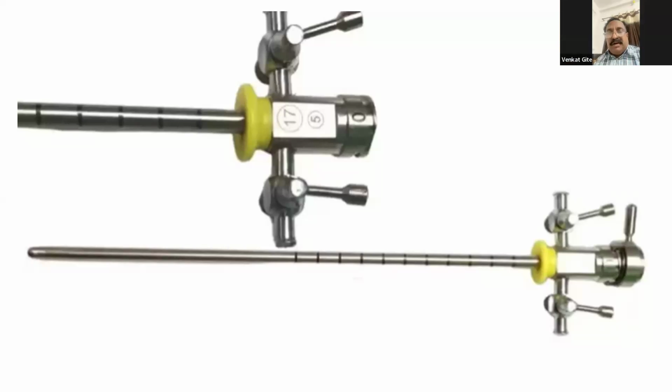Yes, please, doctor. So the 17 French cystoscope is called a female cystoscope. There is a reason behind that. The rest of the cystoscope sheaths have a long beak, and if you use that long beak inside the female urethra, which is short, the leakage of fluid and water is more and vision will be poor. That's why the 17 French sheath came into existence. Because its sheath beak is small, leakage is less, so it is more useful in females. That's why it is called female.